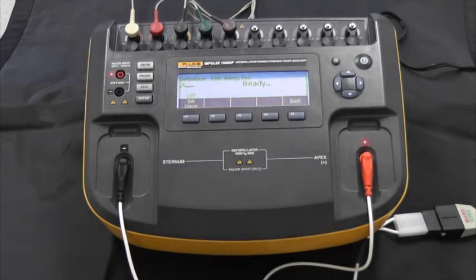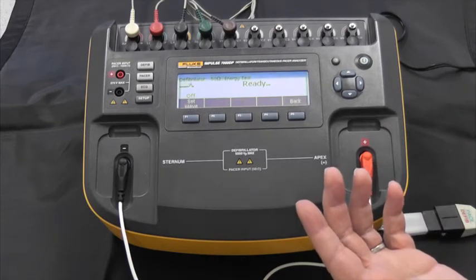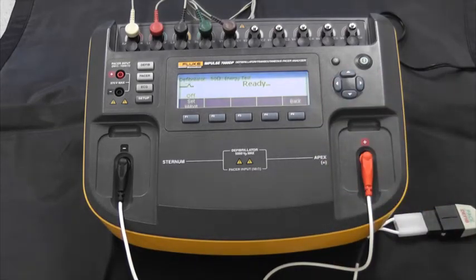Let's pick defib energy. We can send a waveform if we want, but the Impulse 7000 is actually ready to deliver energy right now. So we just charge up our defibrillator — we have 20 joules selected to deliver our energy. You can see that we immediately get not only the energy level displayed on screen, but we get the wave pattern as well. So in this case it's monophasic. It tells you what it measured and what it saw based on the energy delivery — that's kind of important.